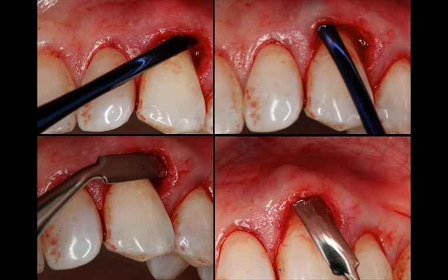Very carefully, be careful not to detach the interproximal tissue, the papillae, and slowly work your way apical beyond the mucogingival junction so you can have the space to insert the graft, to have good vascularity, and to some extent, it'll allow you to reposition some of this tissue coronally when the time comes.